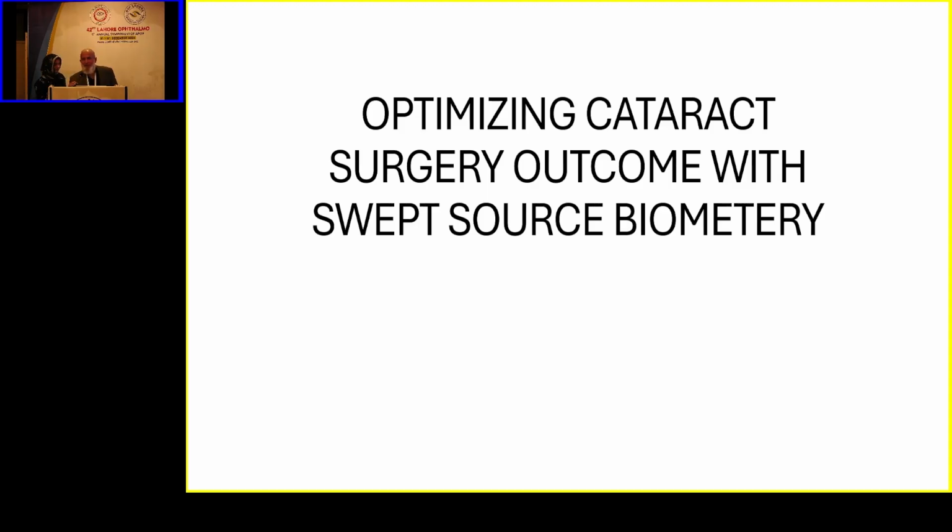I tell people doing small things in a great way is the main aim. So whatever we do, we must do it in a great way. So the first step that we do in cataract surgery, this is the first step. Dr. Sharoon is going to elaborate.